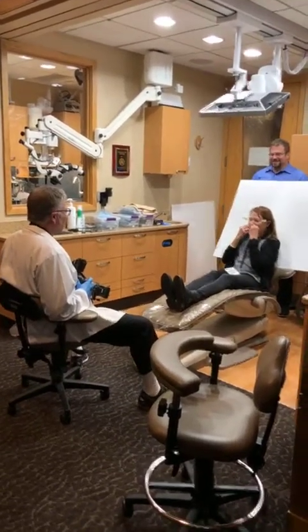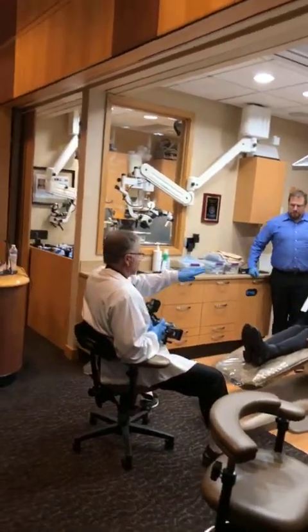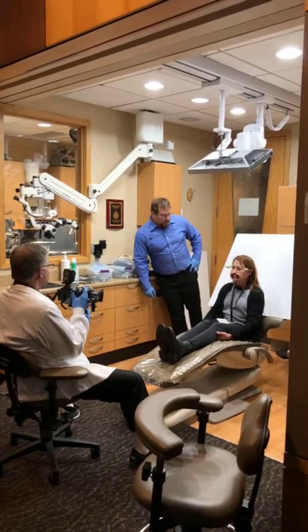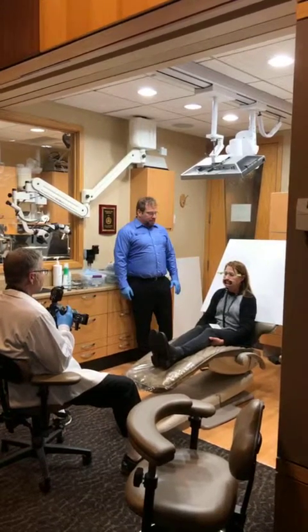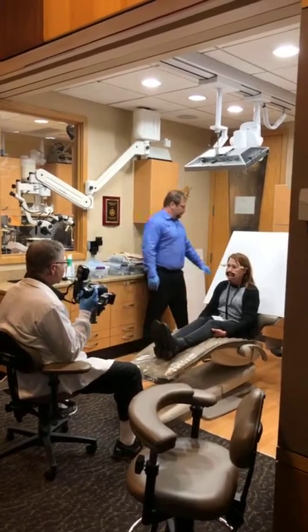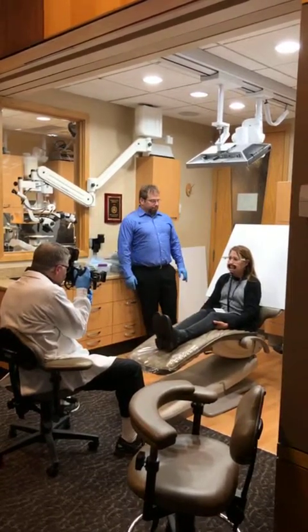Let's go ahead with photos. Sit forward, a little further from the back. Tip your head just a little — bubble levels in the middle, bubble level on the side. Now don't move. I'm going to take my camera — we should have raised the chair a little, Nancy is a bit shorter. Stay like that. Is the bubble level right? Now I'm going to take this picture.